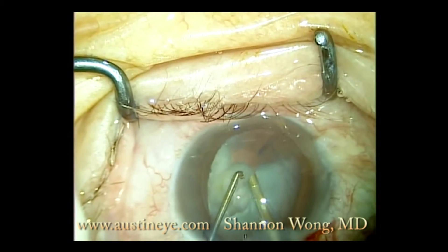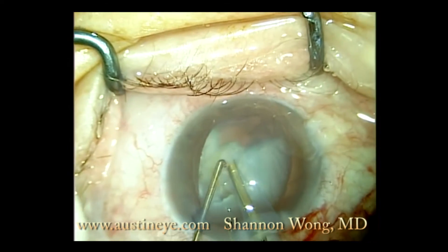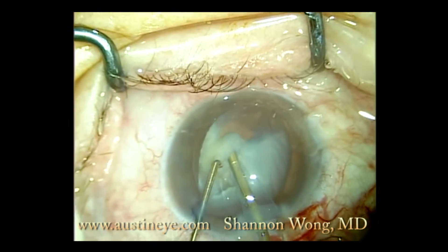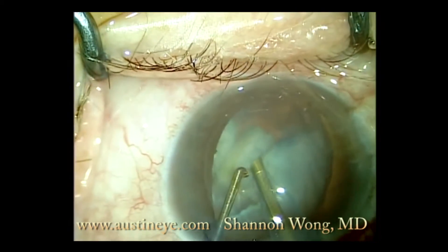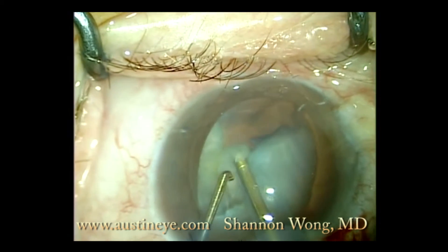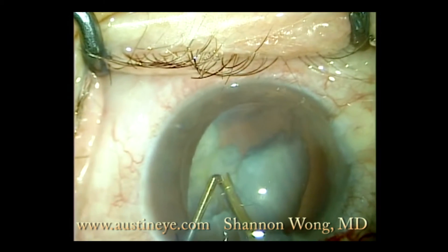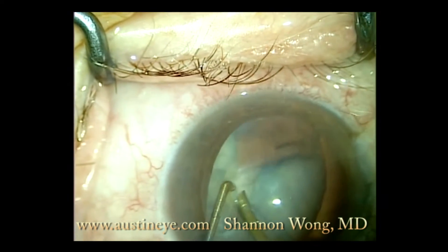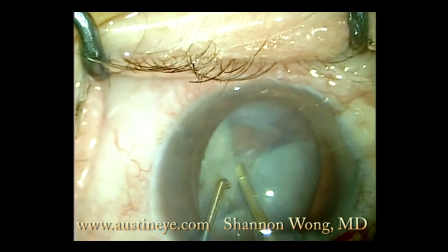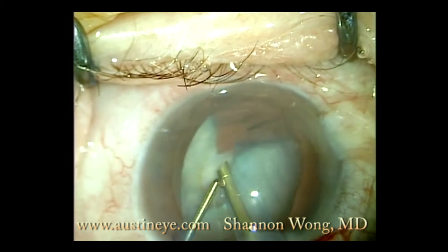So we're phacoing in the bag, but we know that this bag, once we take out a majority of the lens, there's not going to be enough mass within the bag to keep it expanded. So our goal is just to remove about half or more of the cataract to create space in the bag.